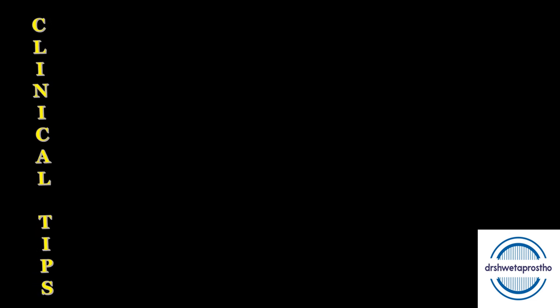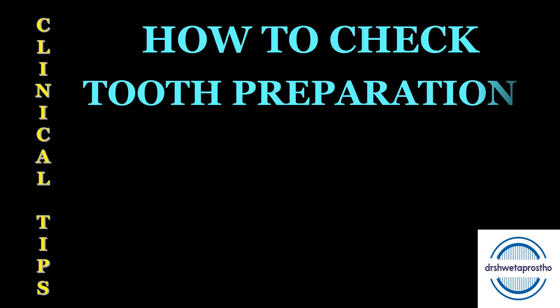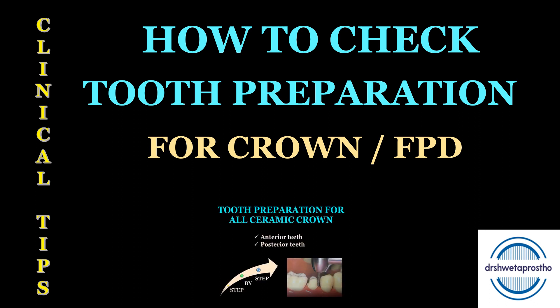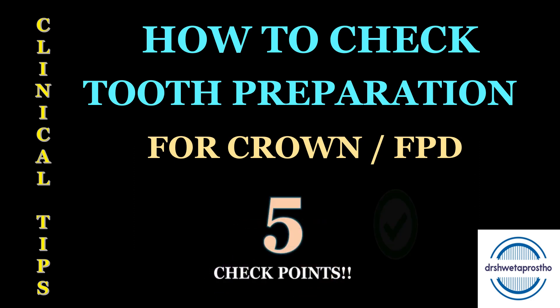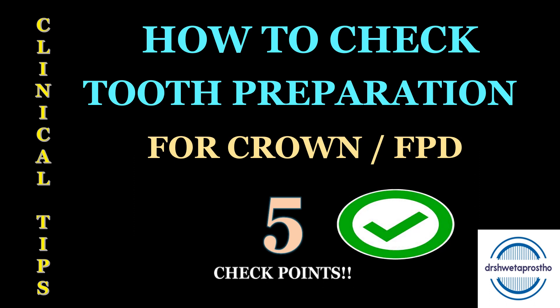Namaskar dear all. Today in the clinical tips section we will be discussing how to check the tooth preparation for crown or FPD. If you want to see the step-by-step preparation or the principles of tooth preparation there are other videos, but in this we will be only discussing the five checkpoints that we will see in the tooth preparation before going for the final impression.